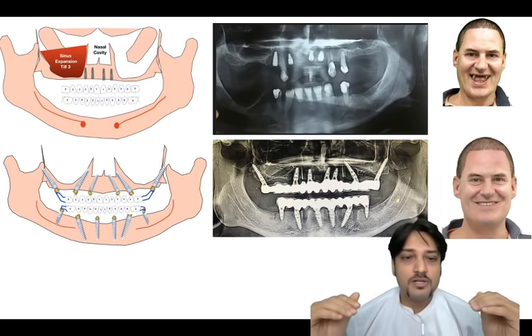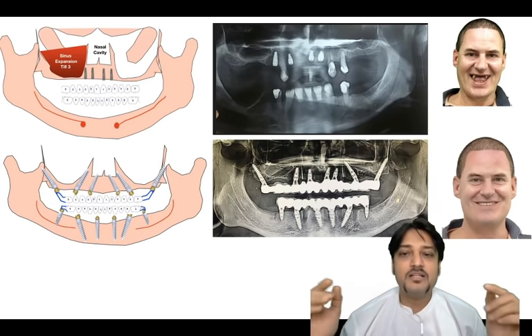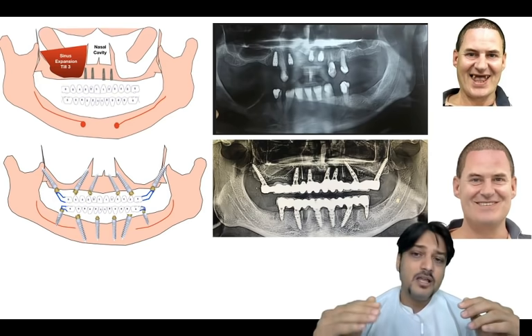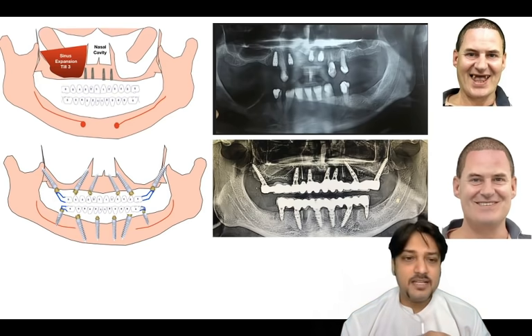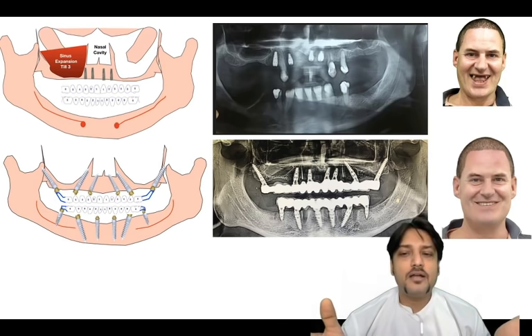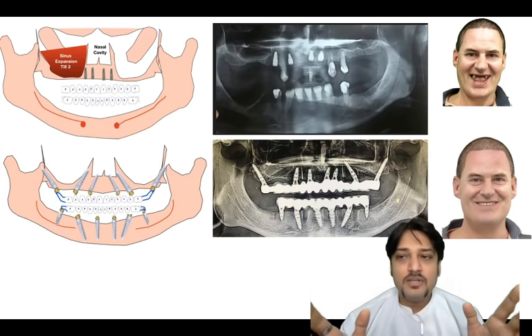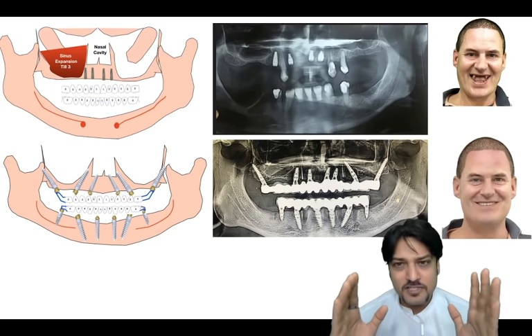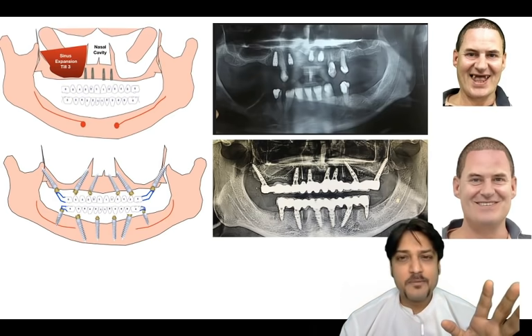So that's what was done. We placed pterygoid implants. We placed one implant in the upper left premolar region, tilted, that is bypassing the sinus, and in the lower jaw the normal way, and then we loaded this prosthesis to the patient. Now this is a happy patient. So if a proper plan is done, we can easily avoid cantilever segments for the patient.